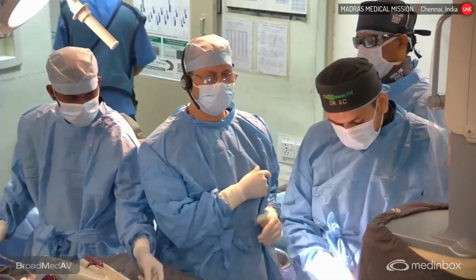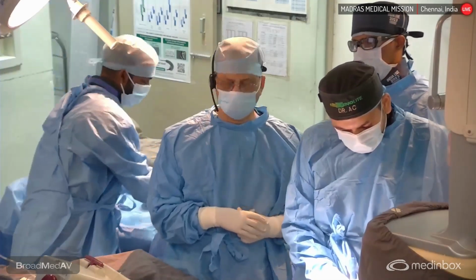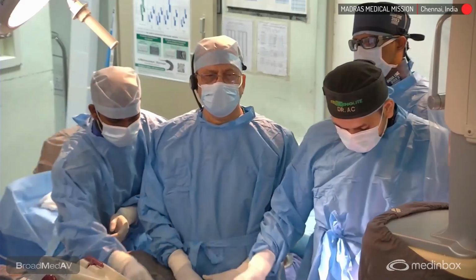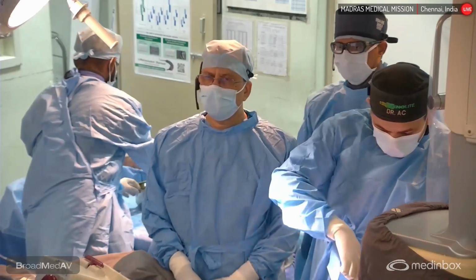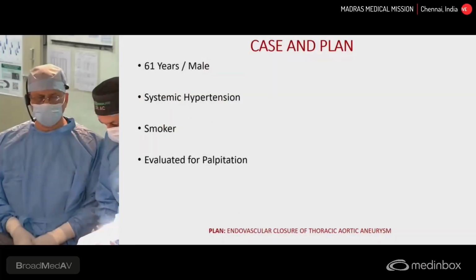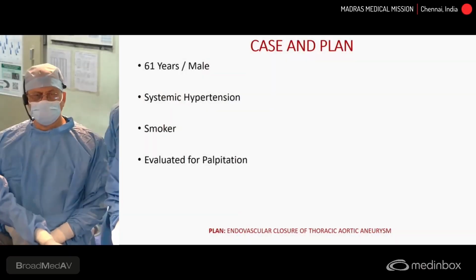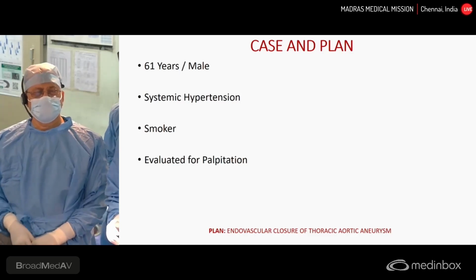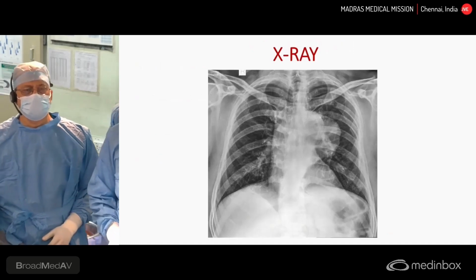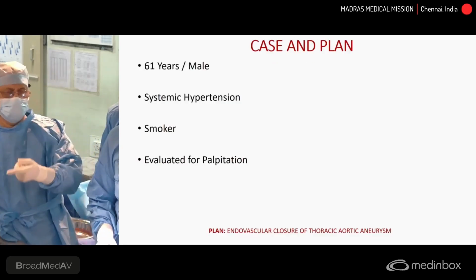I am Dr. J. Alan. Along with me are Dr. Nandakumar and Dr. Ashish Chopra, consultants at Madras Medical Mission. Today, for MedStream 360, we are going to present a case of thoracic aortic aneurysm. It's a saccular aneurysm. We are going to show the endovascular closure of this aneurysm.